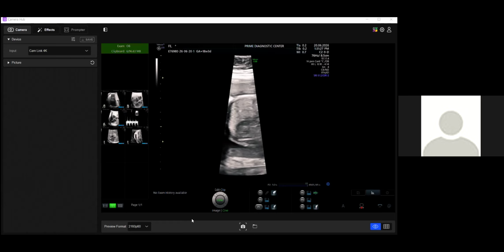Less than 35 to 40 is the cutoff. Fractional shortening has significance? No, I hardly use it. By the time I see fractional shortening bad, visually I see the ventricles are not good. It doesn't help. I'm interested when visually I'm not sure what it is, and then I need some support from my measurement to help me whether there is an LV dysfunction or RV dysfunction or not. Unfortunately, none of the techniques have really helped.